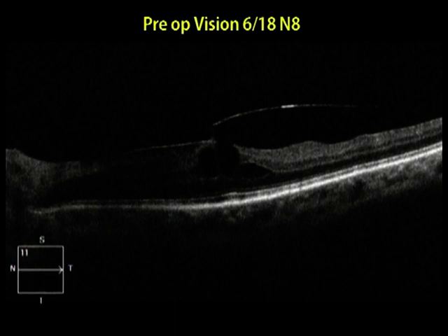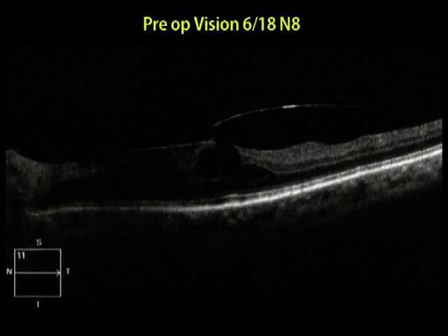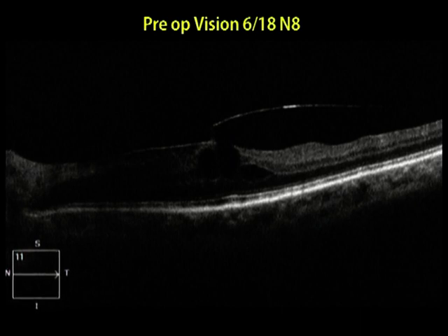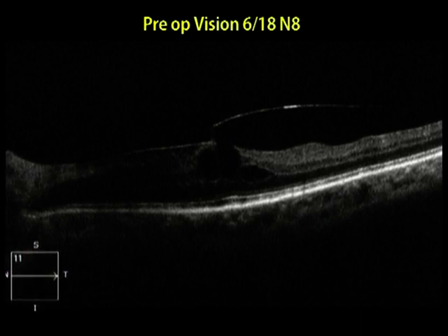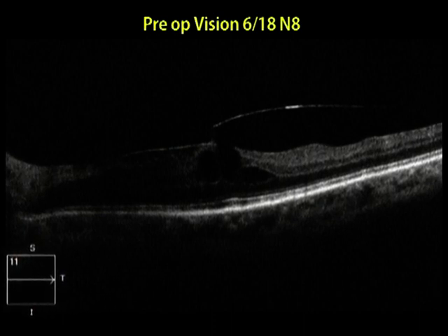A typical epiretinal membrane and on the temporal side, posterior vitreous detachment was present along with separation at the outer plexiform layer. Following the extreme success of the inverted internal limiting membrane flap technique by Michel Visca and extensive work by Shio De, the surgeon decided to go for an inverted ILM flap in this case too.